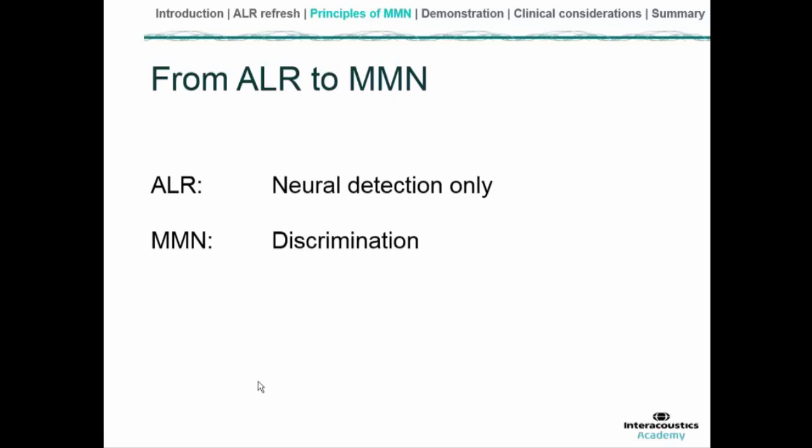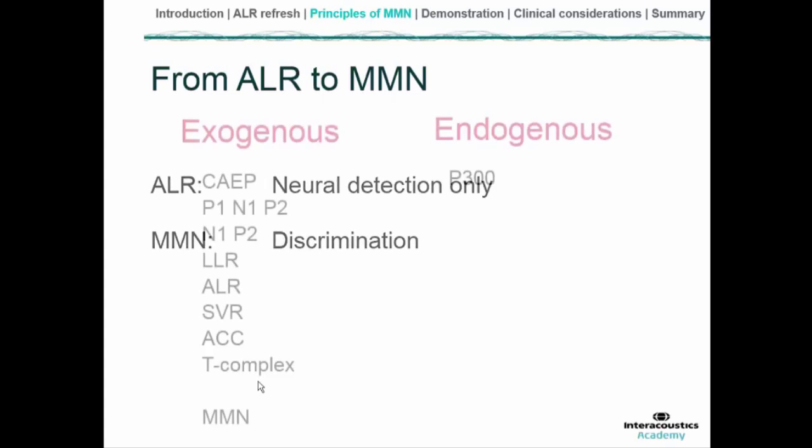Of course, I appreciate that's a rather crude analogy in many ways, but it's true to say that the MMN is only evoked when a sound is perceived as different to another, according to certain limitations that approximate the behavioural discrimination threshold for the particular sounds in question. So we have a waveform that occurs as a result of the process of discriminating between two sounds.